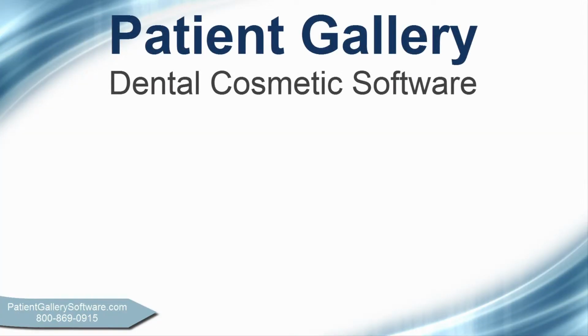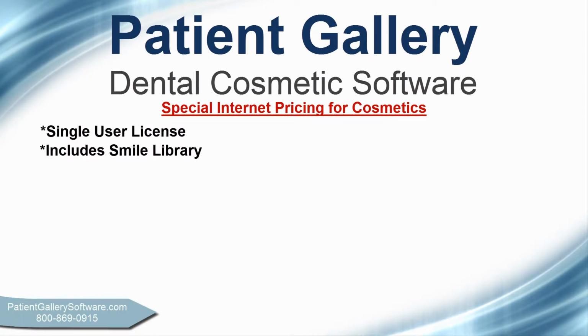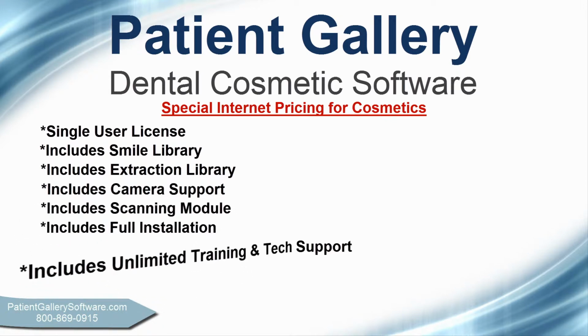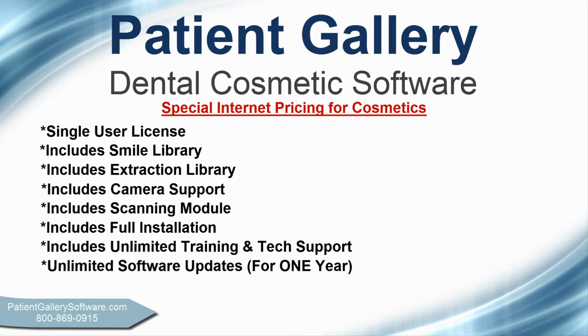Okay, let's take a look at the internet special we're running on Patient Gallery right now. The special would include, of course, the Cosmetic software with a single user license. We would also include our Smile library. Also included would be the extraction library, and this has been specially designed just for dental offices. This program also includes the camera support, scanning support, full installation, and unlimited training and technical support. Also, 1 year's worth of software updates.